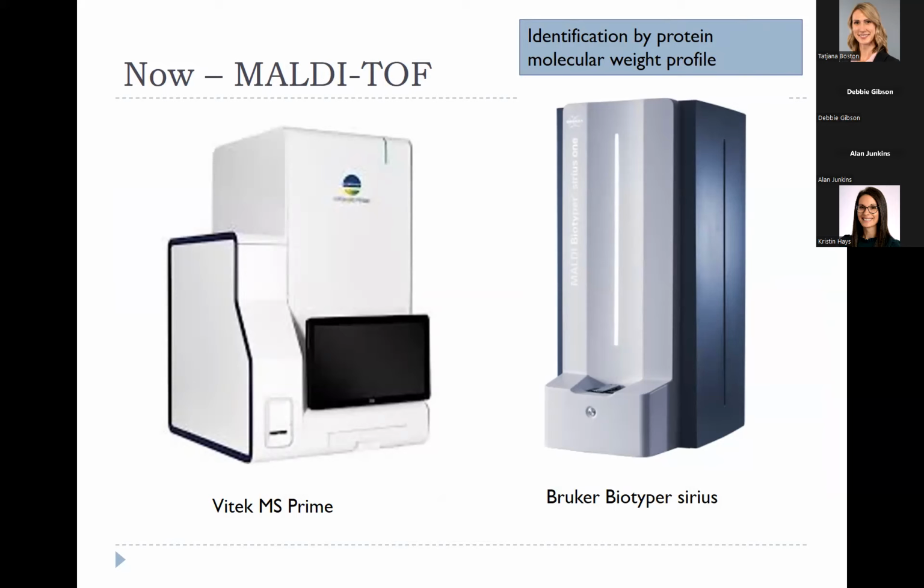Matrix assisted laser desorption ionization time of flight mass spectrometry. It's mass spec, which we never thought we would use.